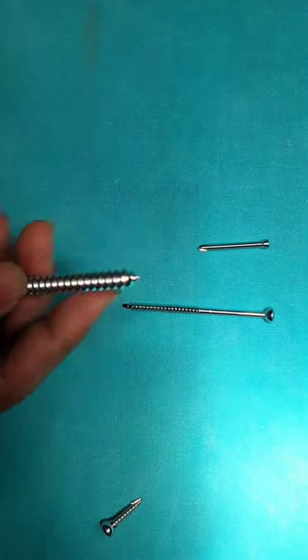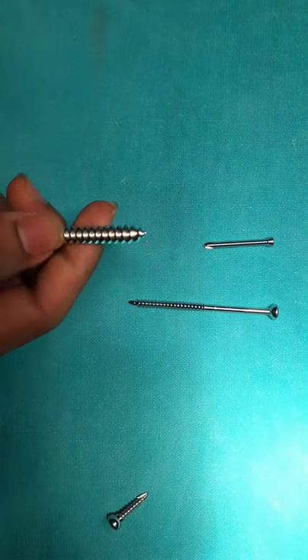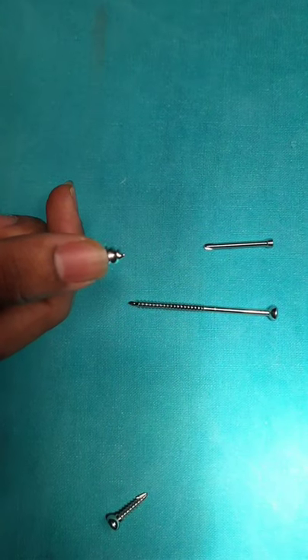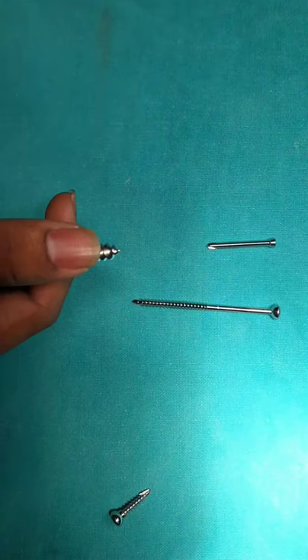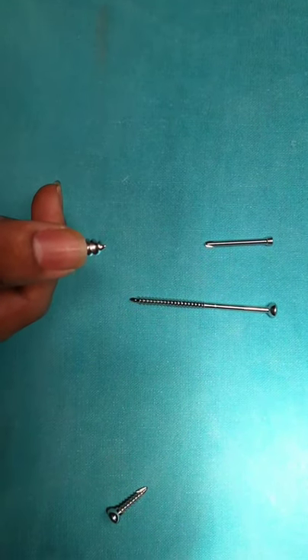This is the core screw tip used in cancellous bone. The tip of the screw is designed as a tapping spiral so that it compresses the trabecular spongiosa of the cancellous bone.